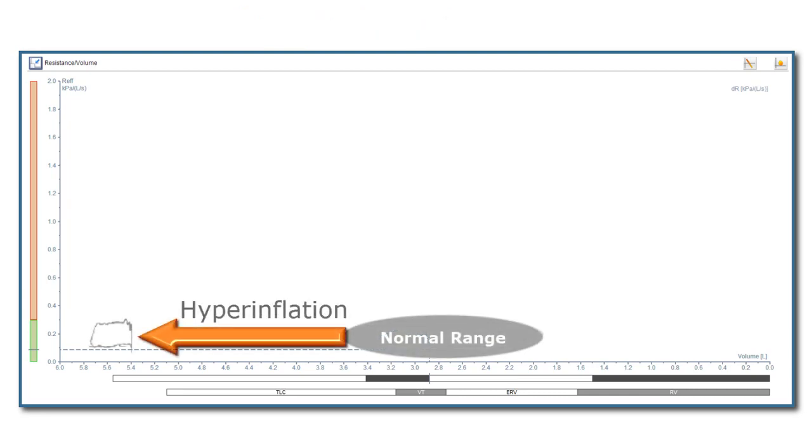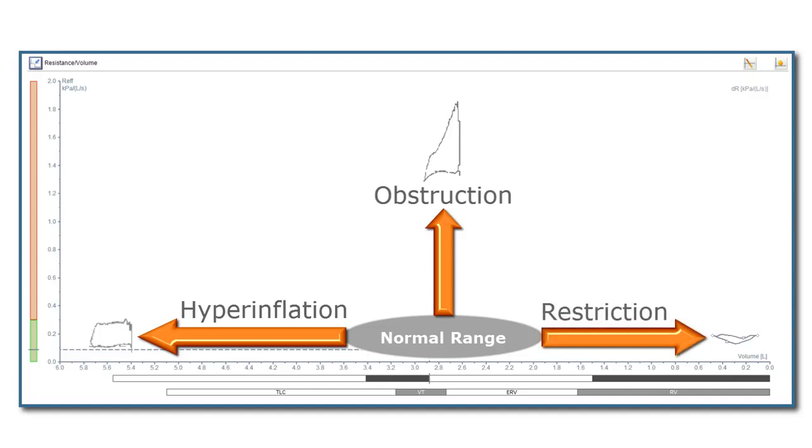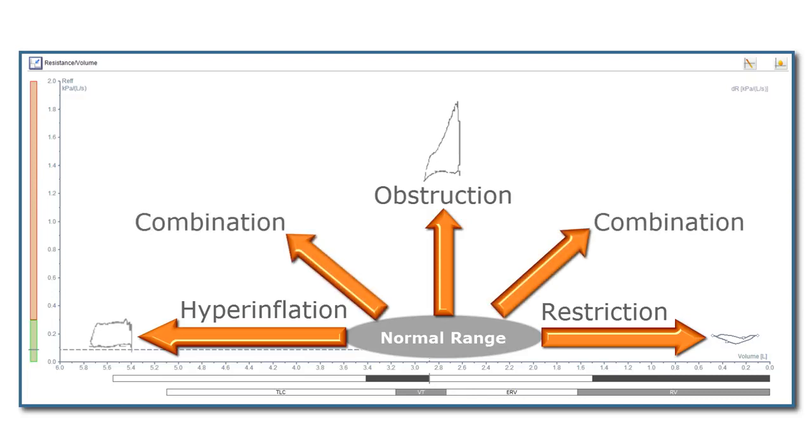When a patient has an elevated degree of hyperinflation, resulting in them breathing on a higher FRC level, the resistance-volume loop will shift to the left. If the airways obstruction of the patient has increased, the resistance-volume loop will move upwards. In the case of restrictive lung diseases, the resistance-volume loop shifts to the right, caused by a reduction of lung volume. Of course, a combination of the different impairments is also possible.